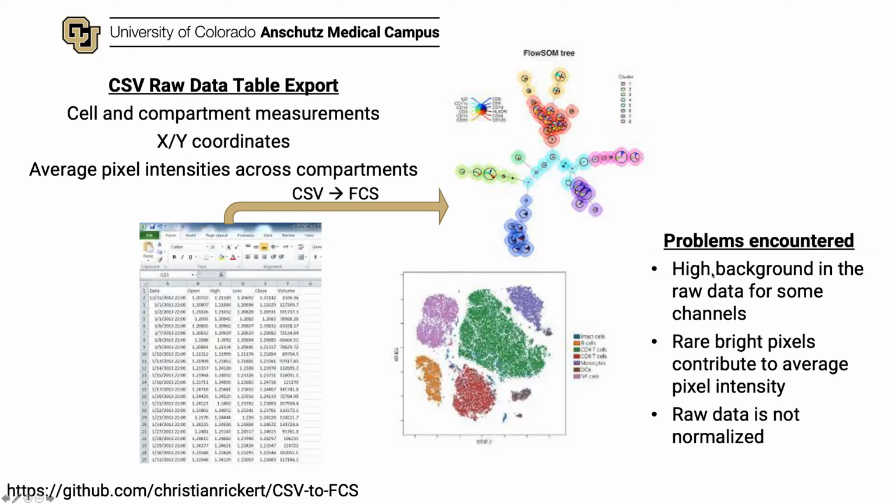This is actually to do with antibody staining. Because the background is so low on the MIBI, you actually see a lot more background from the cross-reactivity of the antibody, or the non-specificity of the antibody, or Fc binding to these antibodies. So there is high background in some of the channels, particularly in those that have low expression molecules where the signal to noise ratio just isn't real great.